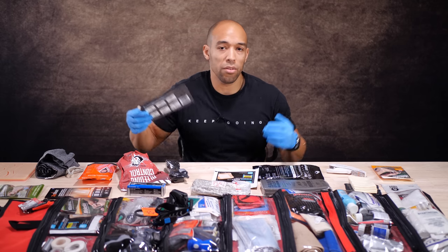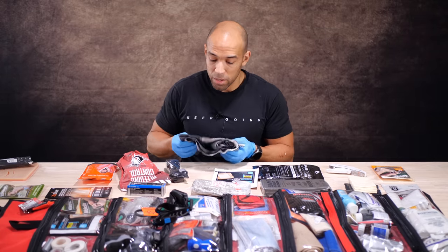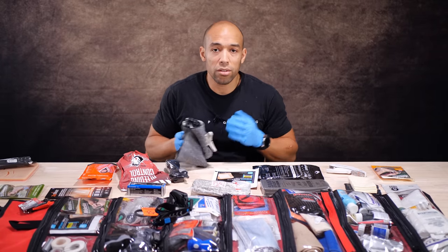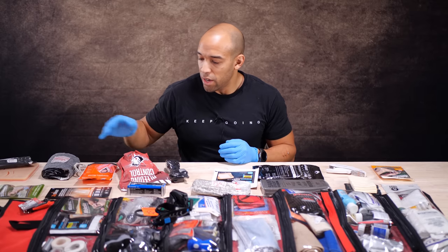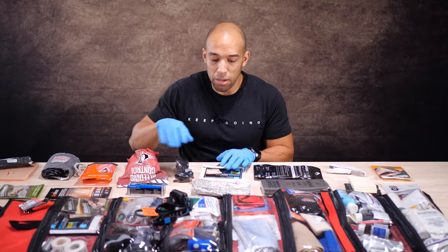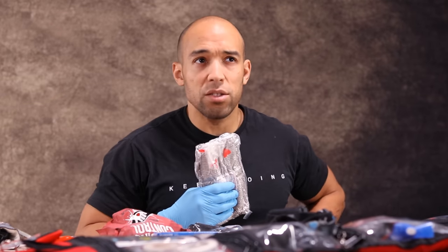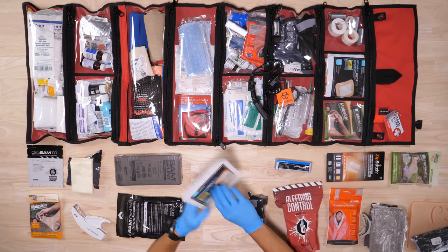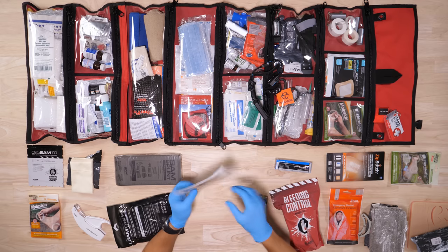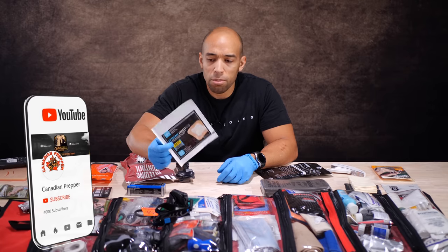There's a more technical name for it — it's called the emergency bandage from Persys Medical. This one has an expiration date of 2027, though we all know expiration dates are mostly there for legal and restock reasons. This is the abdominal version, so if you had a chest wound, stomach wound, or gut wound, this is what you'd use.